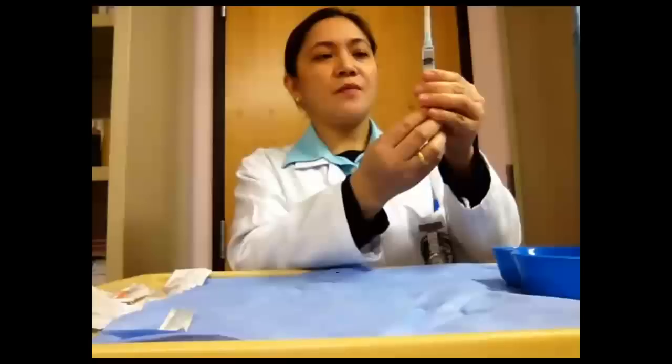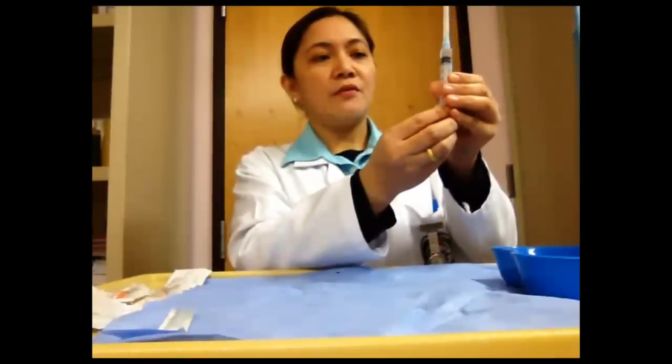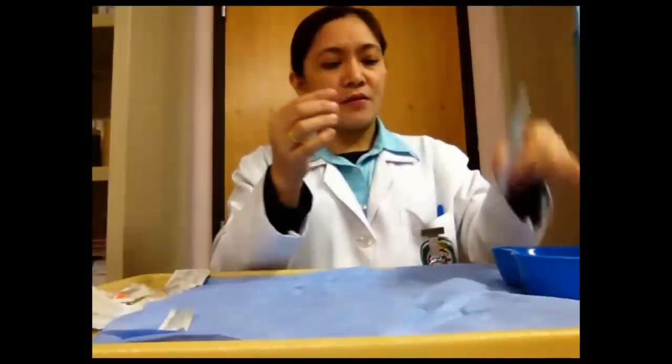Again, tap the syringe and remove some air or bubbles, and make sure that you have only the correct amount of medication, which is 1 ml. Okay, so our second medication is ready.